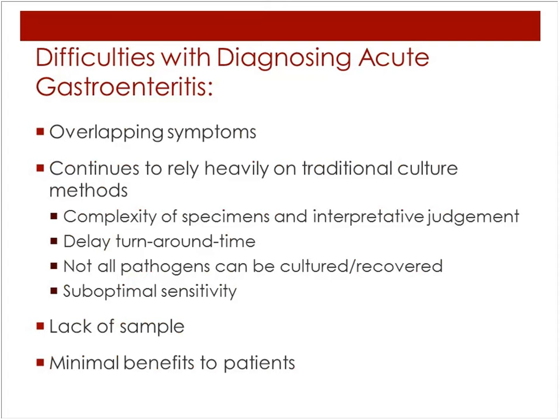Most institutions continue to rely heavily on traditional culture methods, which is associated with its own issues, including complexity of sample types, interpretation, judgment, and significant delays in turnaround time. It's also not really a standalone test, and a lot of the pathogens associated with gastroenteritis cannot be cultured or recovered by traditional methods. The sensitivity, as I mentioned before, is also a big issue when it comes to culture, and it's not uncommon to detect nucleic acid from a sample that was culture negative.